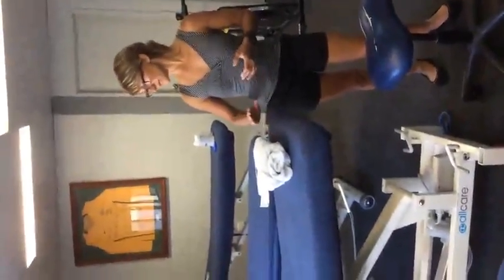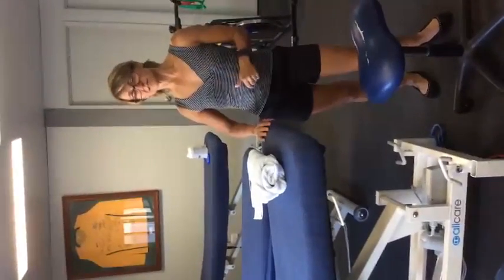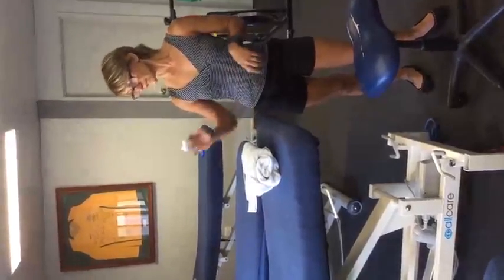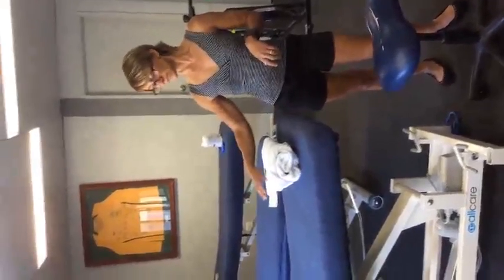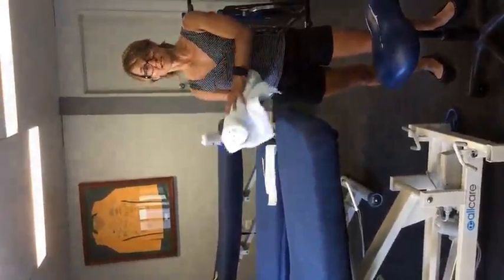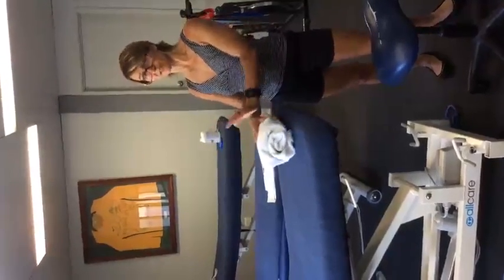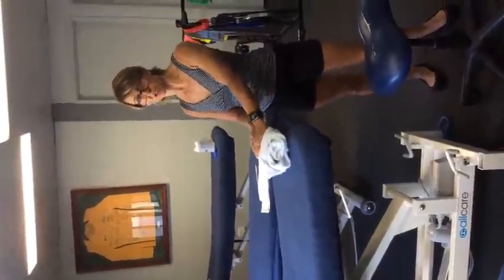So we'd obviously use the bed. We need to make sure that it's set to the correct height, that the brakes are on, and that it has clean linen on the bed. We're also going to use a towel to place under the patient's knee, and that also needs to be clean and freshly laundered.